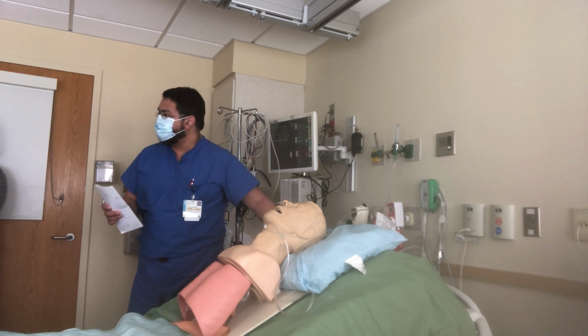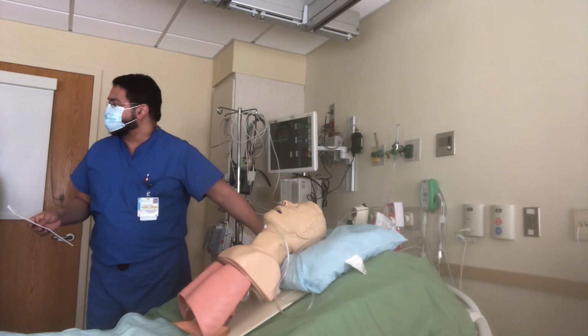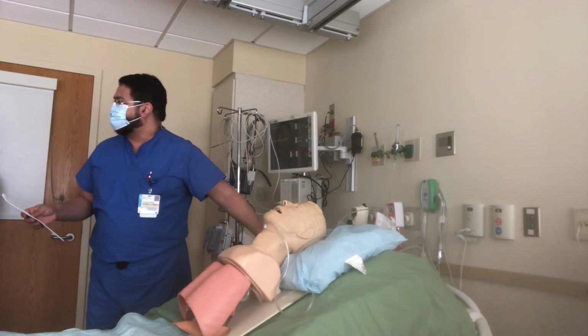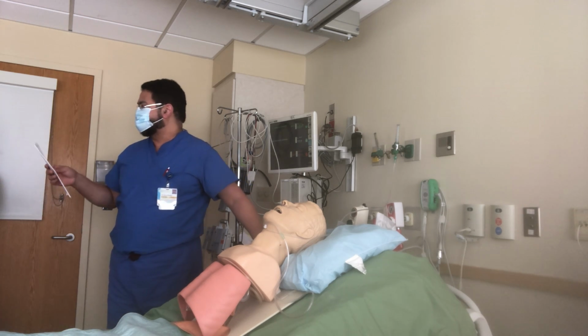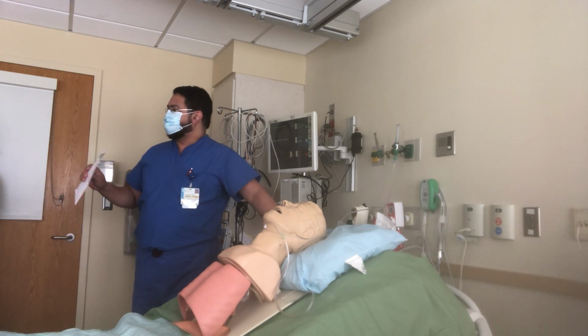Somebody get the airway box, please. Quick, yes, airway box. Call the attending to come. When she comes in, I'll send somebody else to get the airway card. Okay, just one second, but let's make it so real. So let's get the airway box first.